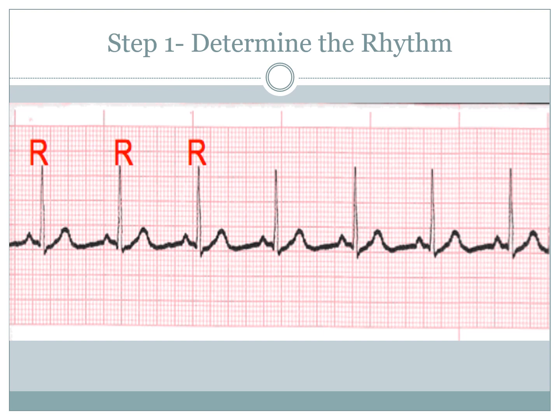So the first thing that you can do is determine the rhythm. Now what we're looking at with the rhythm is consistency. So right back at medical school, you heard all the people say, is it regular? Is it irregular? Is it regularly irregular or irregularly irregular? And you're just like, what on earth are these people talking about? What the hell is the difference? It's either normal or it's not. Okay? But there is a difference.